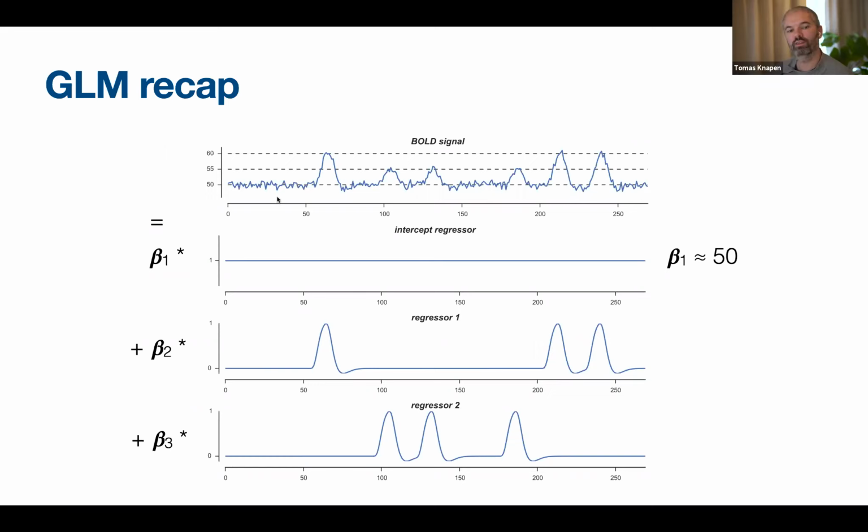And if you look at an fMRI image where you have this type of time course for all voxels, then if you fit this intercept, that would be the anatomical image in the background, right? It doesn't change over time. That's the essence of the anatomical image. Here, this is 10, of course, because you need to multiply this model time course by the value of 10 to gain this signal that goes up to 60, right?